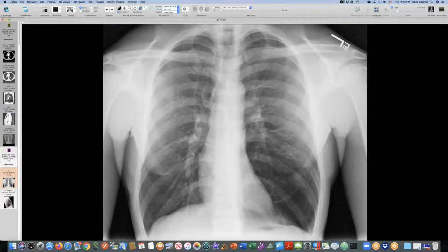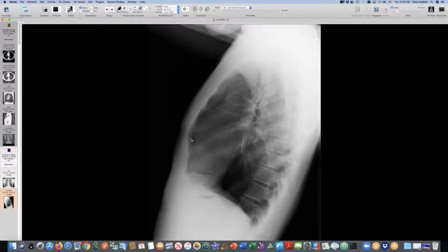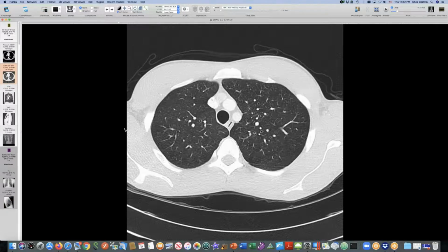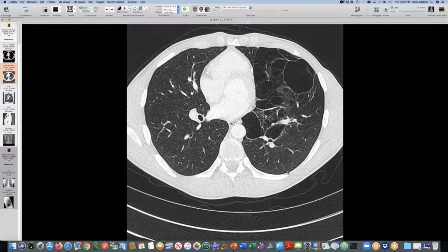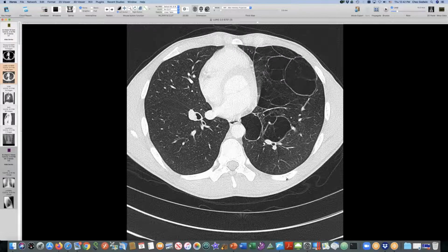And then this young man, I think in his 20s, has this cystic abnormality in his left lower lobe, these very clean bubbles. Lucid, yeah. And it's a left lower lobe abnormality. It's coming up anteriorly, and so you start to wonder, could this be lingula? But I really think what's happening is the border with the lingula is just being pushed north there by this extensive cystic abnormality. The rest of the lung is clean. This doesn't look like a post-infectious sort of thing because there's no component of scarring around it.